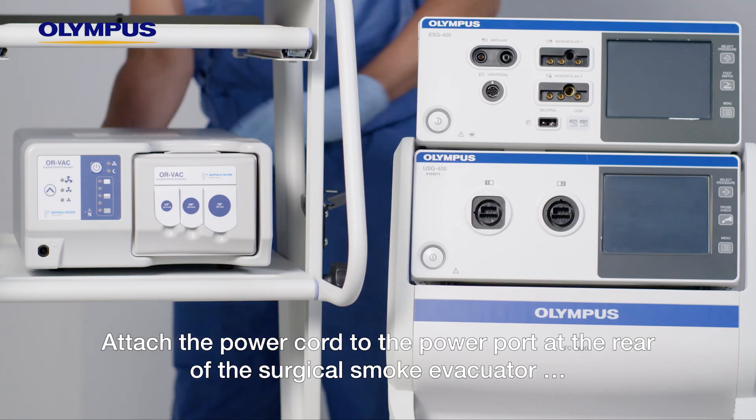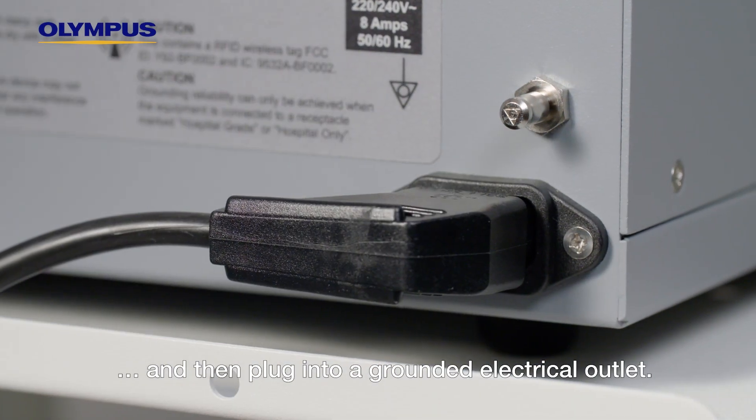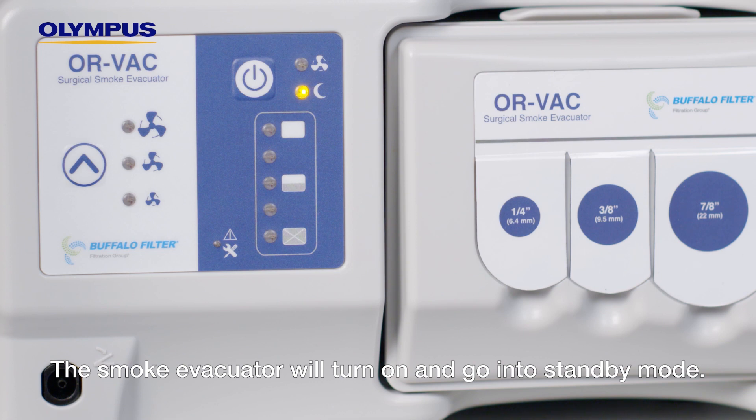Attach the power cord to the power port at the rear of the surgical smoke evacuator and then plug it into a grounded electrical outlet. The smoke evacuator will turn on and go into standby mode.